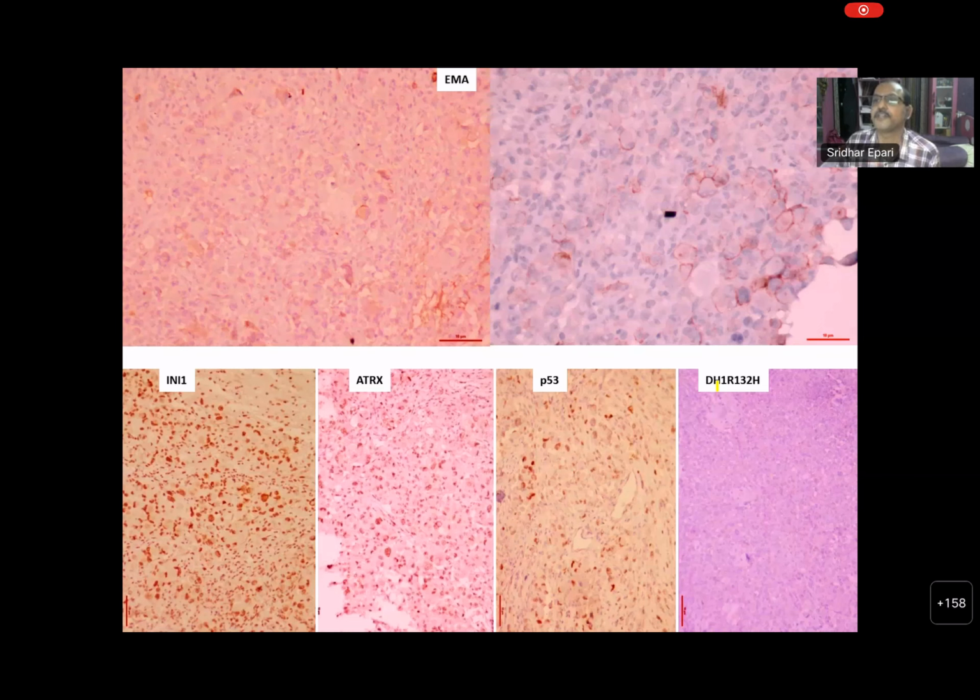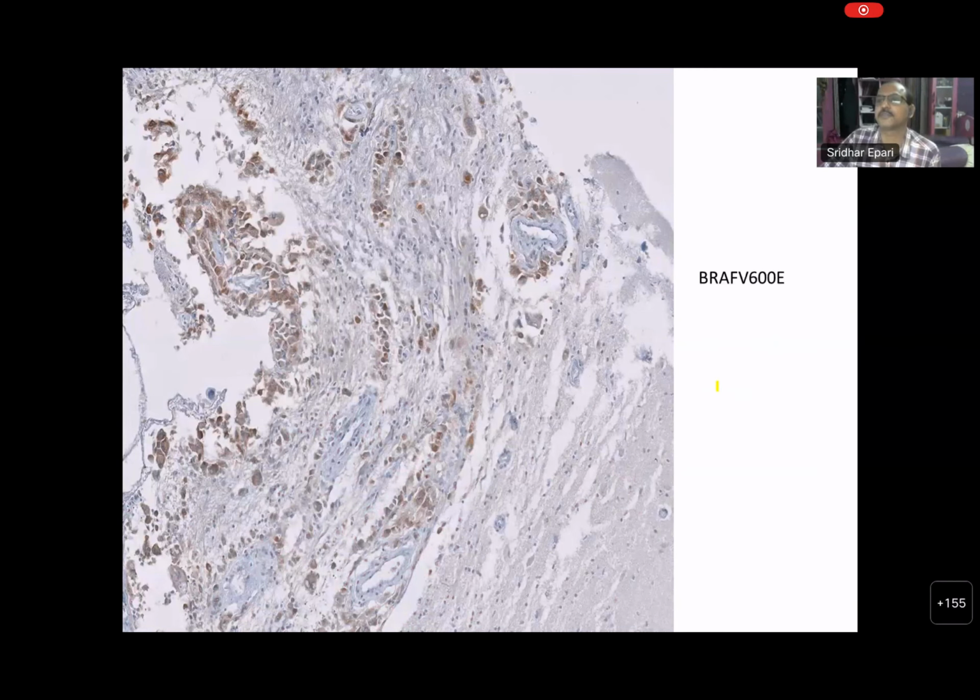Here you saw the tumor is uniform in appearance across the entire tumor, so your possibility of epithelioid glioblastoma is very high priority. Irrespective of it, epithelioid glioblastomas are predominantly BRAF V600 mutant, so you can ask for BRAF, which is also available for immunohistochemistry. This is another immunohistochemistry for a mutant-specific BRAF. You demonstrated cytoplasmic positivity. I put this picture to show how the normal tissue is negative, only the tumor cells are positive, and the endothelial cell is negative.